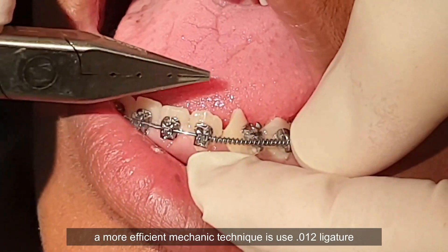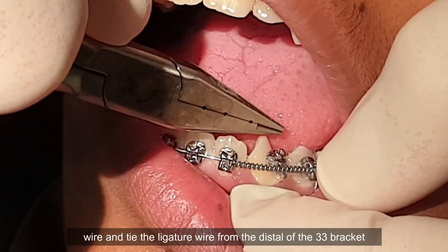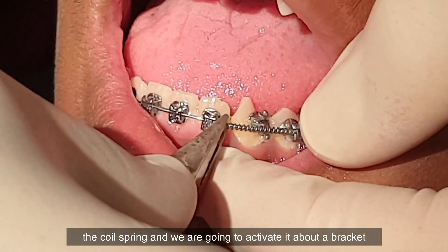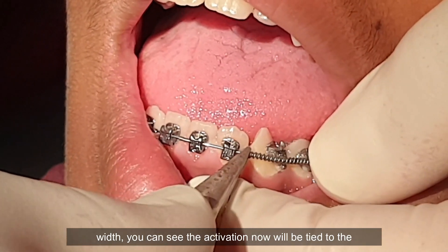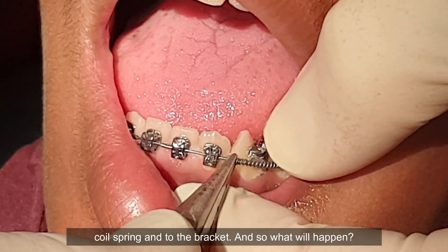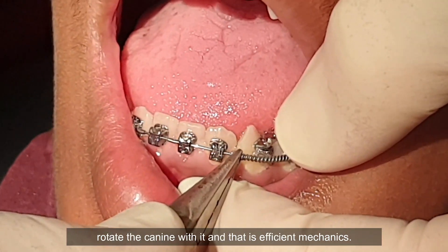After doing that and there's some space created, a more efficient mechanic technique is to use 0-12 ligature wire and tie the ligature wire from the distal of the 33 bracket onto the coil spring. Now watch what happens — as we activate the coil spring about one bracket width, the activation will be tied to the coil spring and to the bracket. As the coil spring wants to return back to its original shape, it will rotate the canine with it, and that is efficient mechanics.